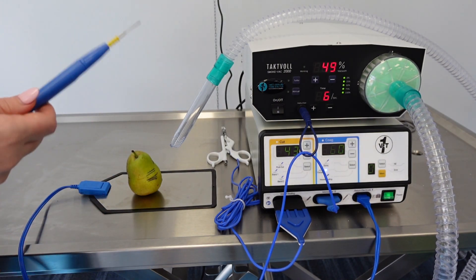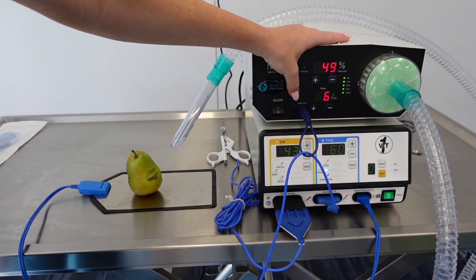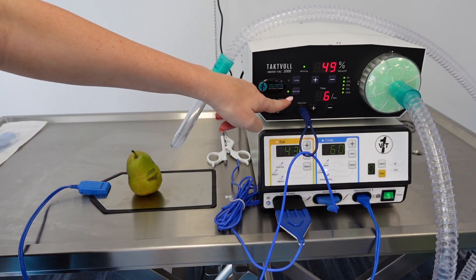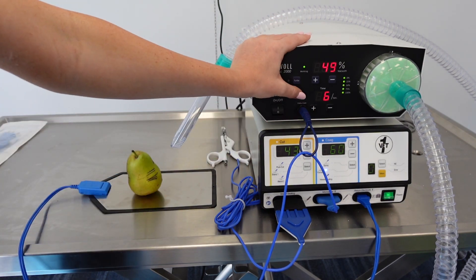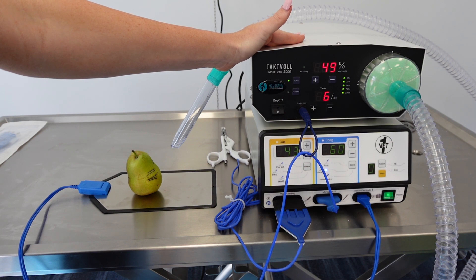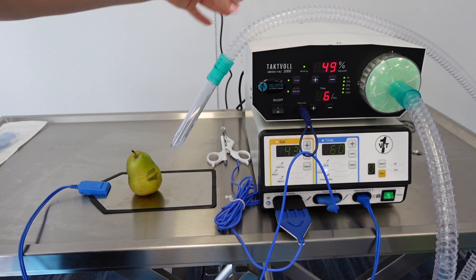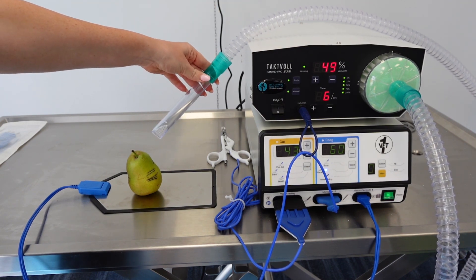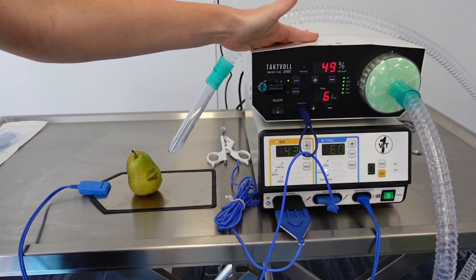If you want constant suction from the evacuation system, press the manual button and it will run continuously regardless of the foot pedal or attachment handle. You can turn that on or off as needed. You can also choose turbo, which provides a little more suction than the standard setting. You can have both manual and turbo on simultaneously if needed, which provides constant high-level suction — ideal if you're not stopping with your electrosurgical unit.